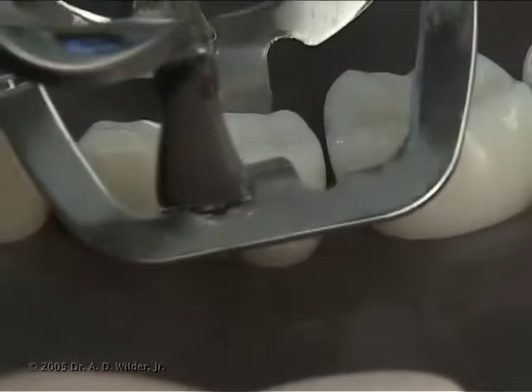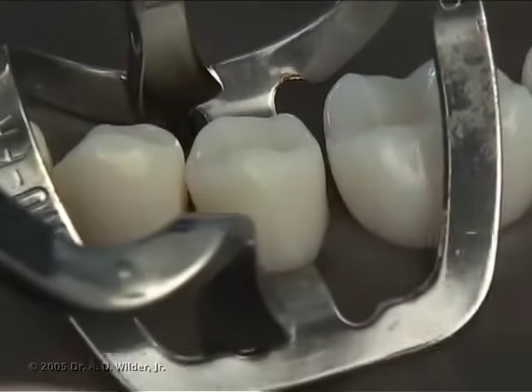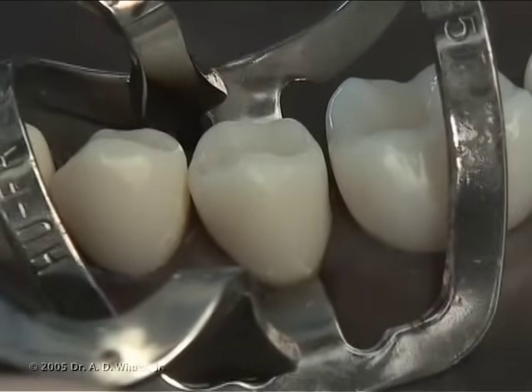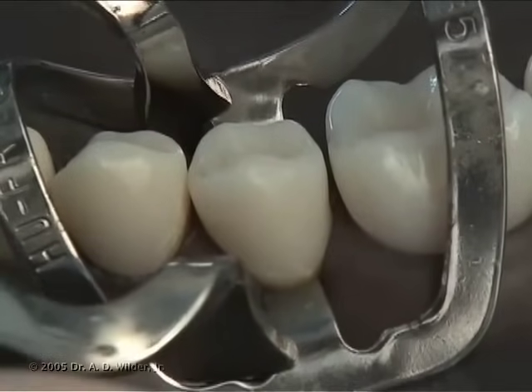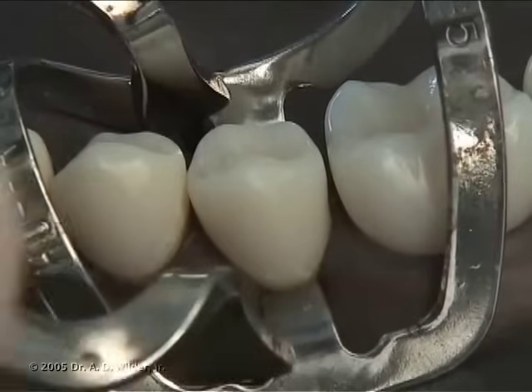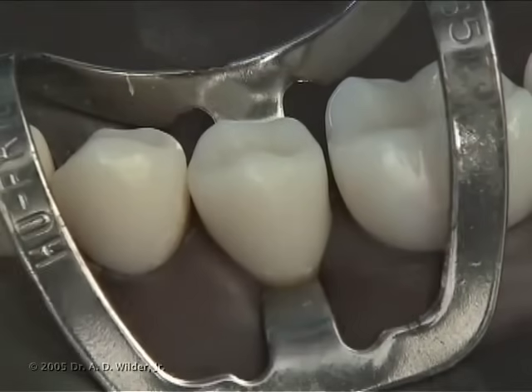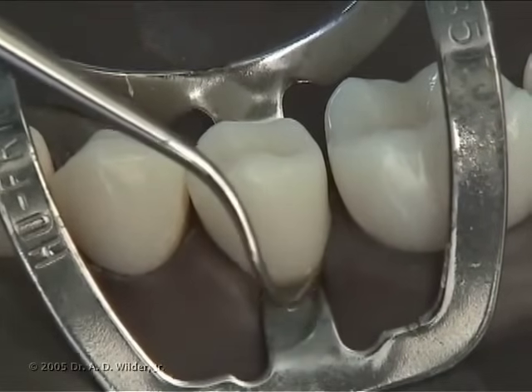In this example, we're using a rubber dam with a B5 rubber dam retainer, but you could also use something similar like a number 212 retainer. Place the lingual jaw apical to the height of contour on the lingual surface first, then slide the facial jaw about 1mm apical to the lesion. Use an explorer as needed to invert the rubber dam into the gingival sulcus.